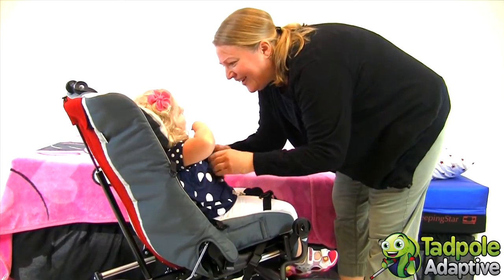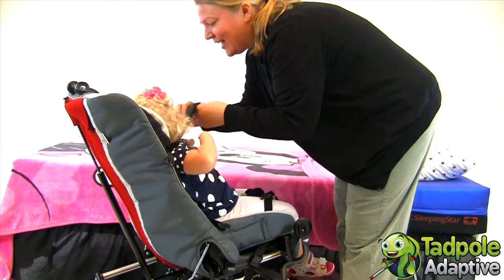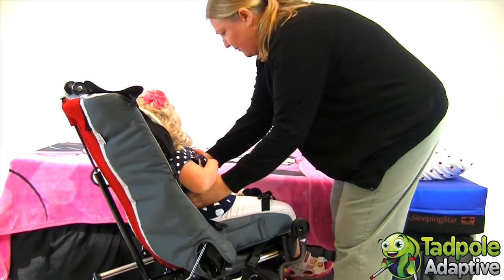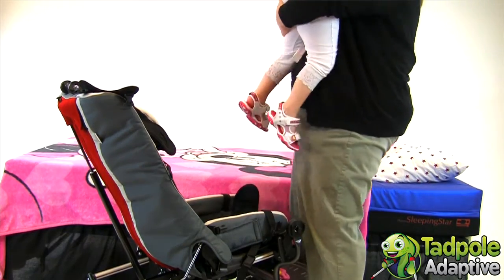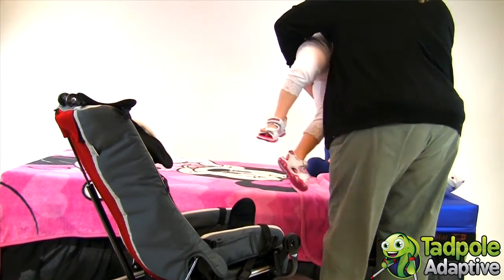This process helps the blood to flow more evenly, brings the child down into a deeper sleep, and we're finding that once the child can be restored in a deeper sleep for a longer amount of hours, their performance the next day at therapy, in school, and in family interaction is much stronger.